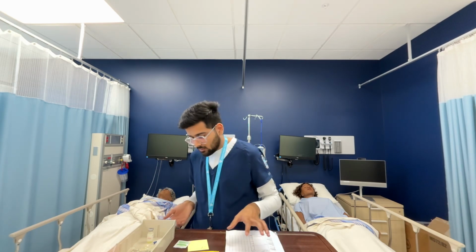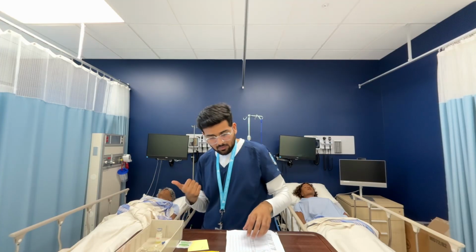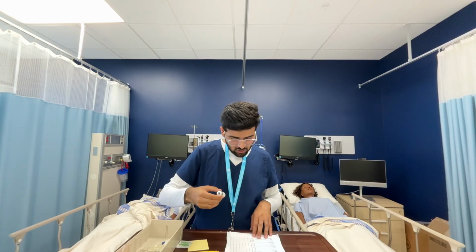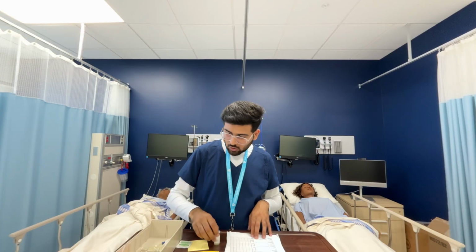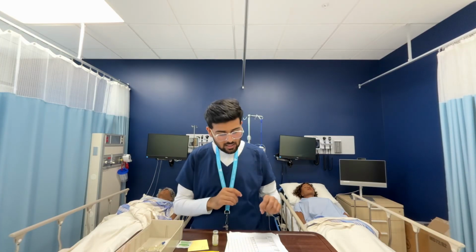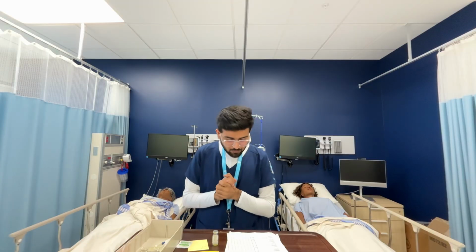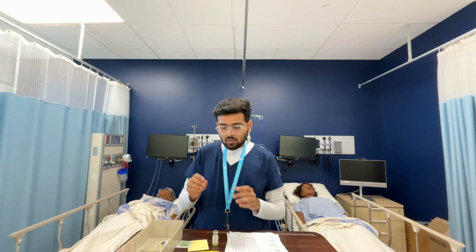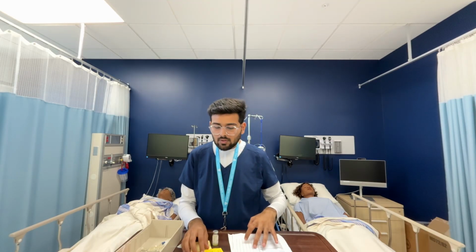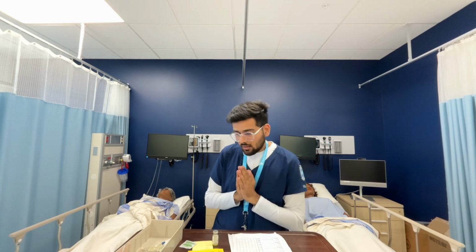For my first check, I'm going to bring out my medication bin. I'm going to go for Fiona Sherrick, right patient. I'm going to get pantoprazole, right medication, 80 mg, right dose. I'm giving through IV, right route, and I'm giving at 1000 hours, right time, and I'm giving twice a day, right frequency. I'm giving because my patient is diagnosed with sepsis. This medication helps prevent stress ulcer and GI bleeding. So I have a right reason over there.